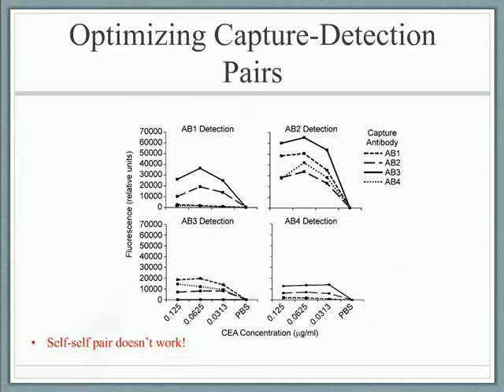And as is well known in developing sandwich assays, if you have a capture and detection targeting the same epitope or a very close region, it's not going to work well as a pair because they compete for the same place on the protein. So that matches up with what we see here, and then we can simply look at the range of concentrations and the shape of the curve as to which one works best. And from this, it looks like using antibody 3 as capture and antibody 2 as detection works best.